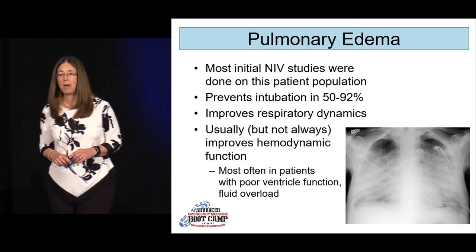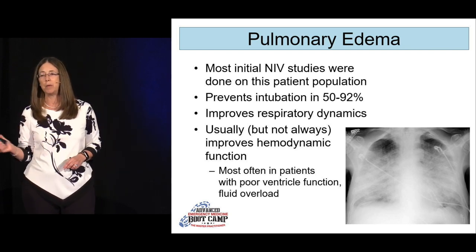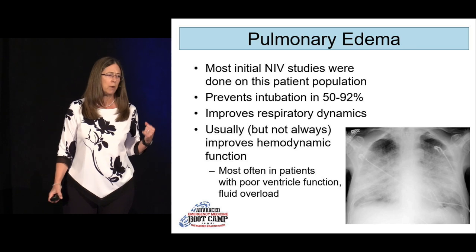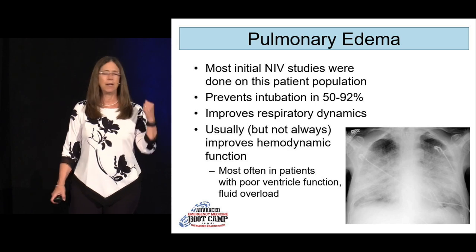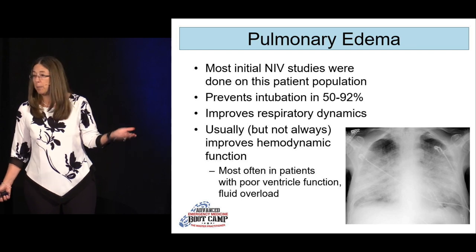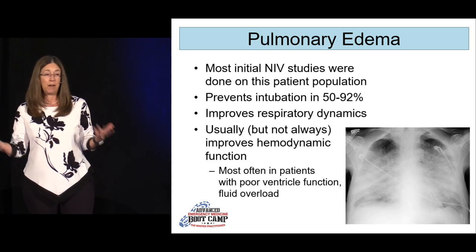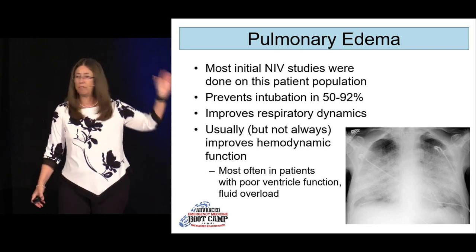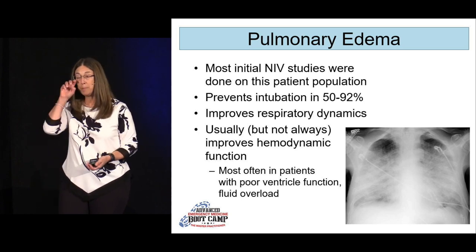You already heard about pulmonary edema, and I will tell you, this has changed the game with pulmonary edema. Non-invasive ventilation has totally changed the game. We've all seen the cases, right? You get the call from the field, and the paramedics are on the radio. It's like, this patient is diaphoretic, and they have crackles to the apices, and they're working really, really hard to breathe. And we have a pre-hospital protocol, many of you do too, where they start non-invasive ventilation in the field, positive pressure, and then bring them in. And not infrequently, if the transport time is 5 or 10 minutes or 15 minutes, by the time they get to us, they're doing Sudoku puzzles. It's like, dude, I'm fine. It can turn them around really quickly. It is magical, absolutely magical, and prevents intubation in up to 90%.